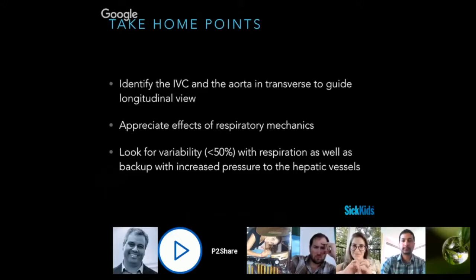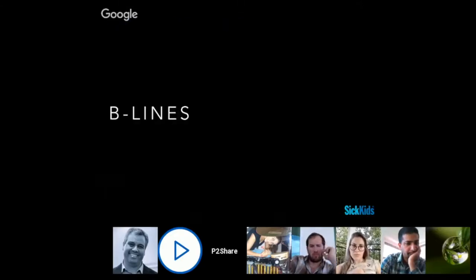You could probably talk about a whole lecture in terms of the IVC and the evidence that's been done there. And I think Leanne already had sent you guys those top 10 reasons why the IVC can be unreliable. Look for variability with respiration as well as backup with increased pressure to the hepatic vessels to guide, is this kid plethoric? But keep in mind that them doing some of the things that you'll read about in the adult literature, like the sniffing test to look for 50% or more, is a lot dictated by the compliance of your patient and their ability to follow instructions. Not something we get a lot of the time for kids.